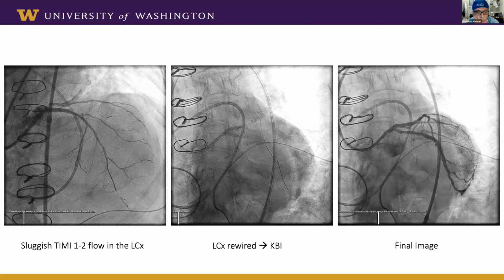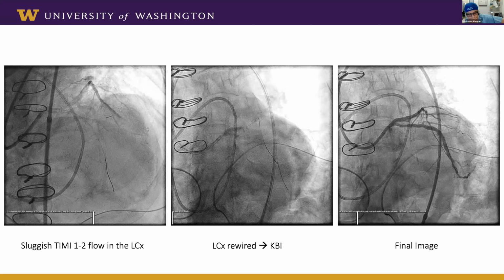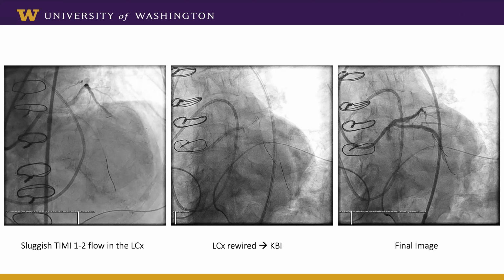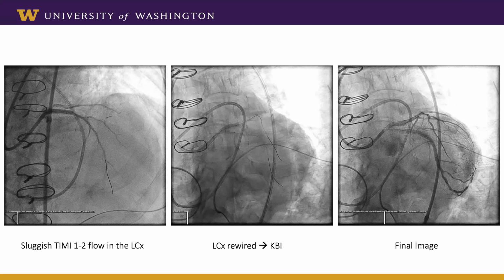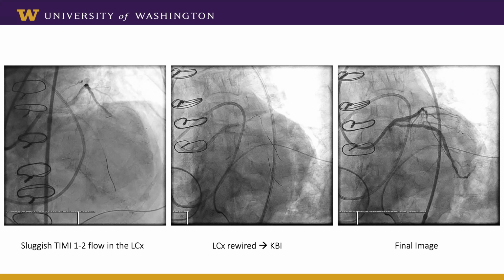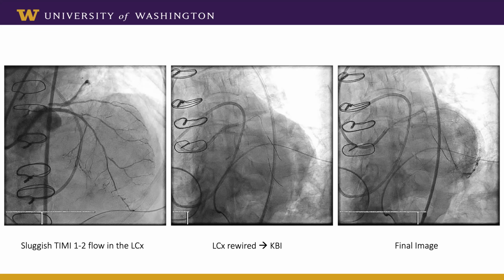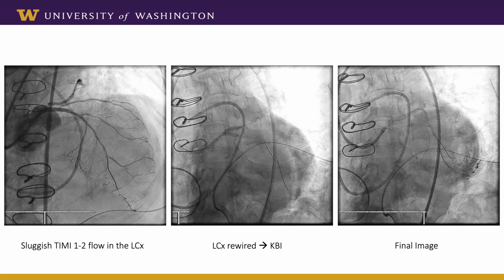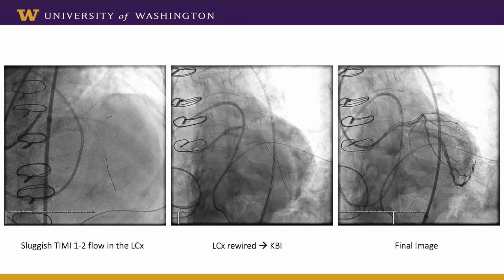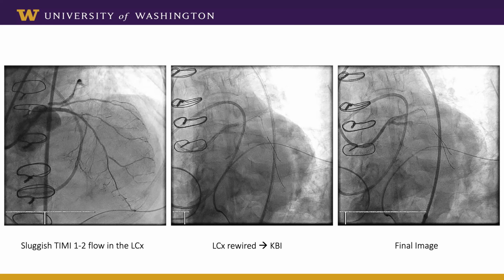Perfect. Kate, what was your anticoagulation strategy during the procedure in a patient like this? Yeah, we talked about that. I almost never use bivalirudin in our lab. That's just not common, though I know other places use it a lot more. It was one of the cases where we actually discussed it, but we ultimately decided the other issue is what to do afterwards if we have any problems. We're so much more comfortable giving protamine on DAPT if we have a good result. So we ended up using heparin, and rather than giving our big bolus doses, we titrated a little more cautiously than normal. But I'm interested, what would you have done?